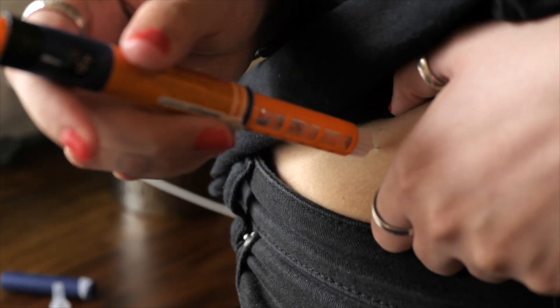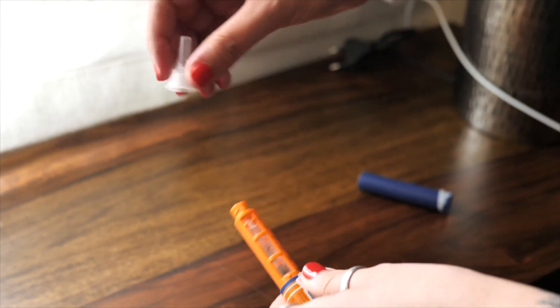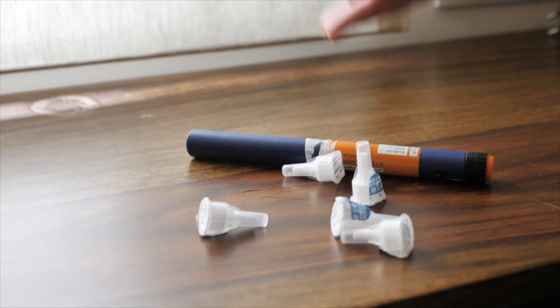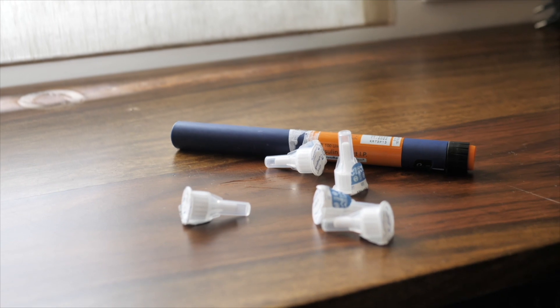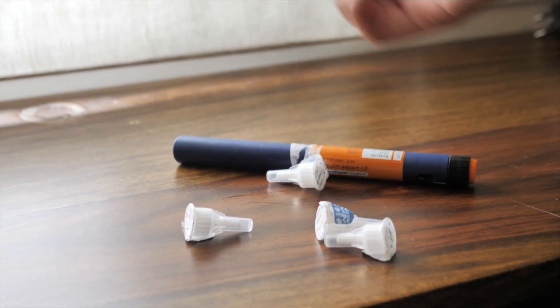After every prick, be sure to remove the needle from the pen and store it in a safe and sterile place. This will ensure no leakage from the tip and also avoid any occlusion or air bubbles. Ideally, the recommendation is to change the needle after every use, but we know that's not always possible, so we recommend changing the needle after six uses.